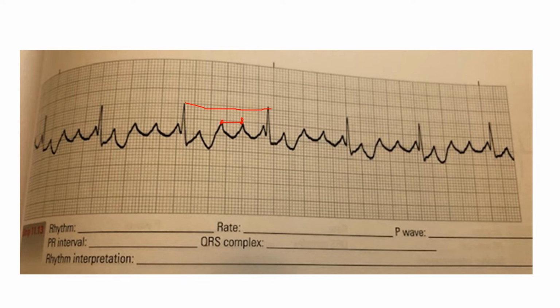And oftentimes they would have elective cardioversion. In a controlled setting, they would get moderate sedation, and then they would have synchronized cardioversion to reverse them back to sinus rhythm. And usually with atrial flutter, they don't require a whole lot of energy to convert them. Usually about 50 joules can do it.